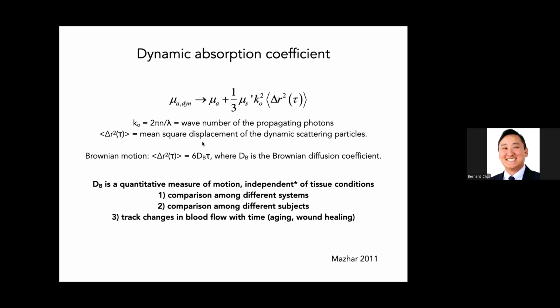The reason we do this is that if we can get this diffusion coefficient out, then consider that I measure something on different days with a normal speckle system, and let's say a grad student or an undergrad bumped the system. Just like with a microscope or anything else, things can get out of alignment, and things aren't going to perform the same way as they did the previous day. Because of the behavior of the system, thermal noise, things like that, there could be differences, and so if you just look at relative changes, that can be misleading.